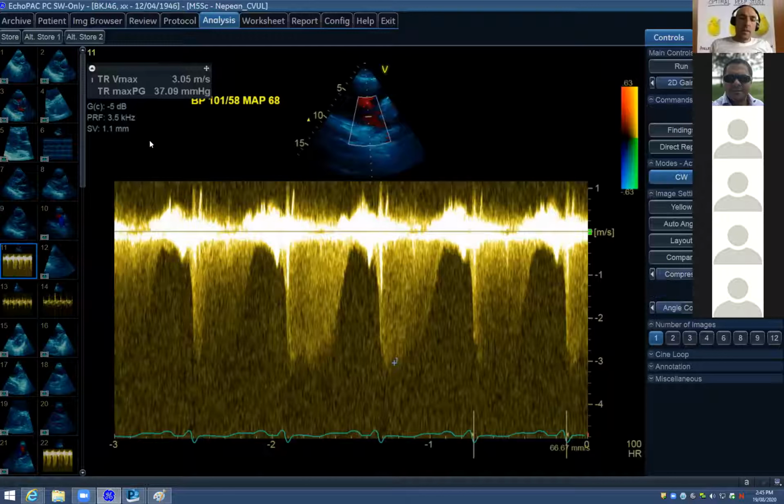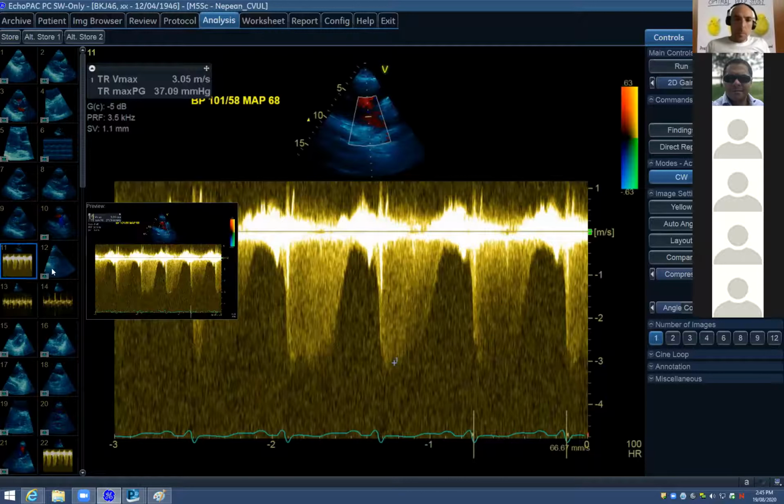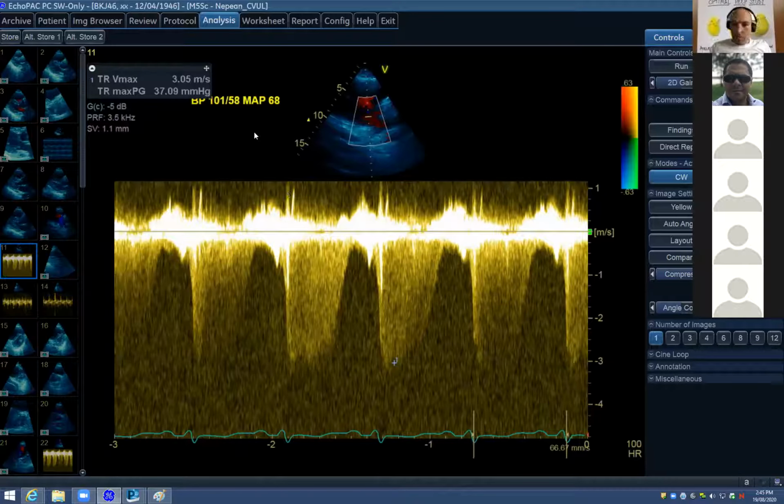Yeah. So we did our tricuspid regurg at about 3 on the last one. What do you think of this? It's still the same. He's still got moderate pulmonary hypertension? I think that Hatim's comment was very prescient, and that what's probably represented is the failing RV and the inability to generate higher pressures.